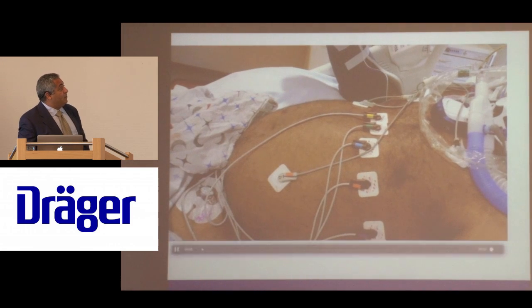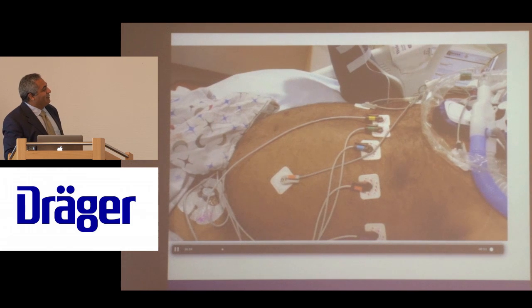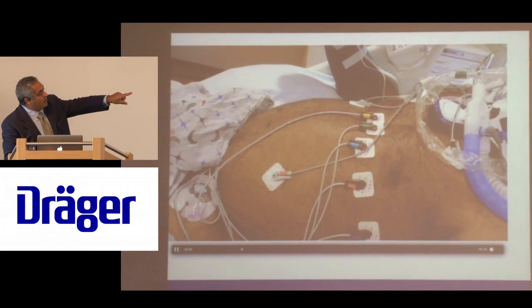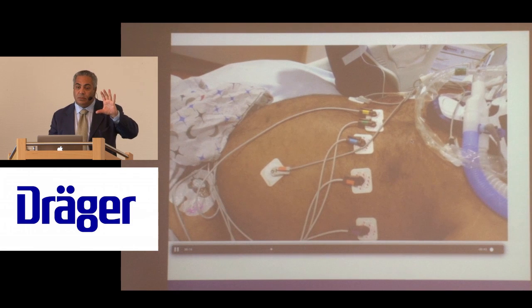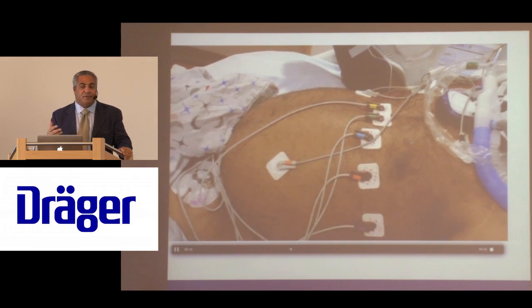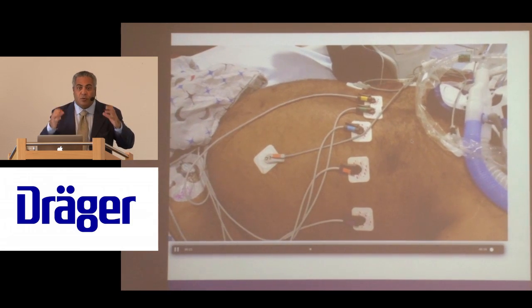Sorry. See how easy I did that? So if you watch here, you see the squeezing, but watch the chest now. When he's finished squeezing, it'll just bounce a little bit. And this is why they can breathe actually at relatively low rates. They're comfortable. We don't have to take away their breathing efforts and control their ventilation.